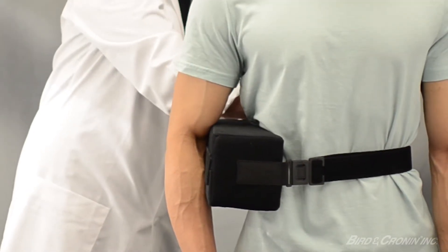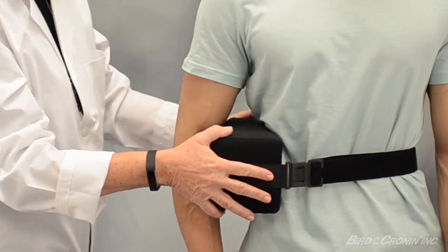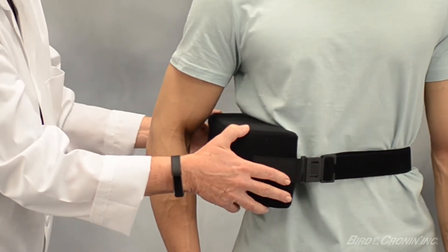Use the hook and loop closures located at both ends of the waist strap to adjust length. Move the pillow to the desired position to achieve proper placement for abduction and rotation.